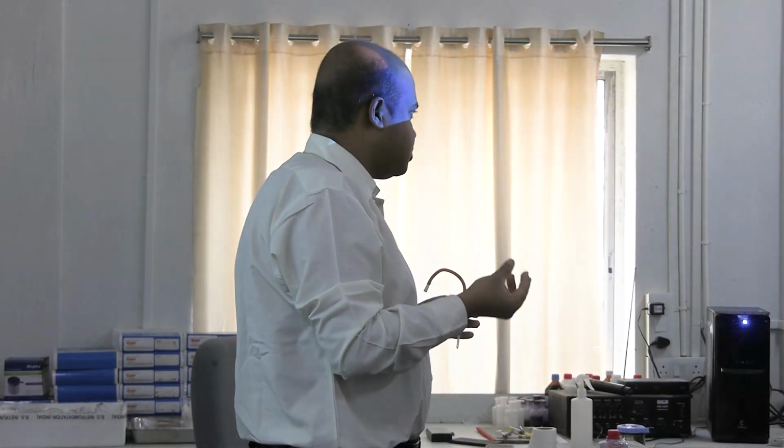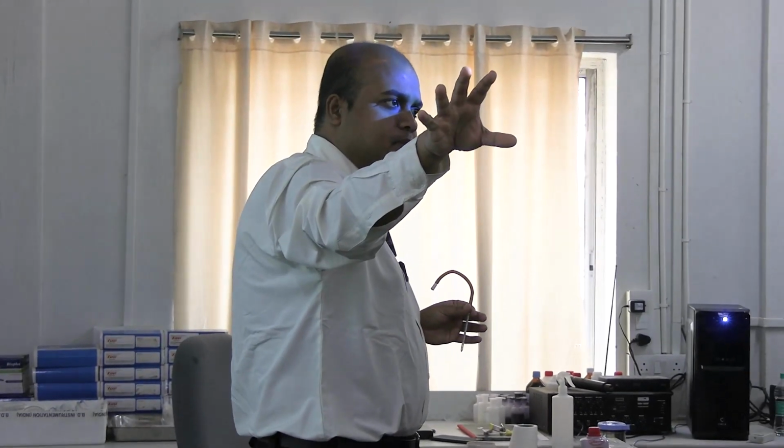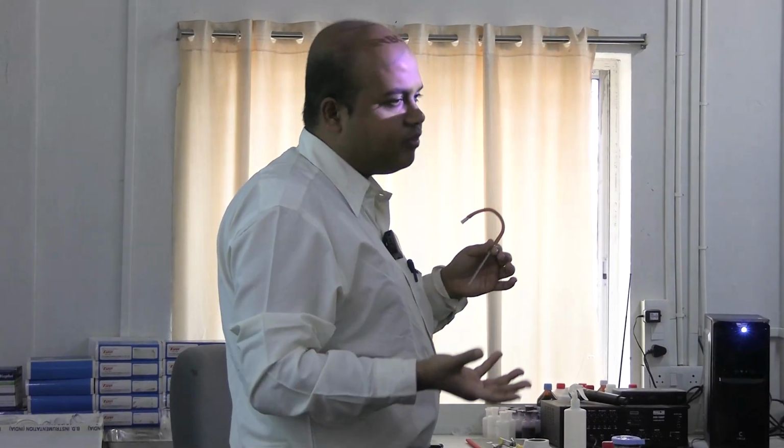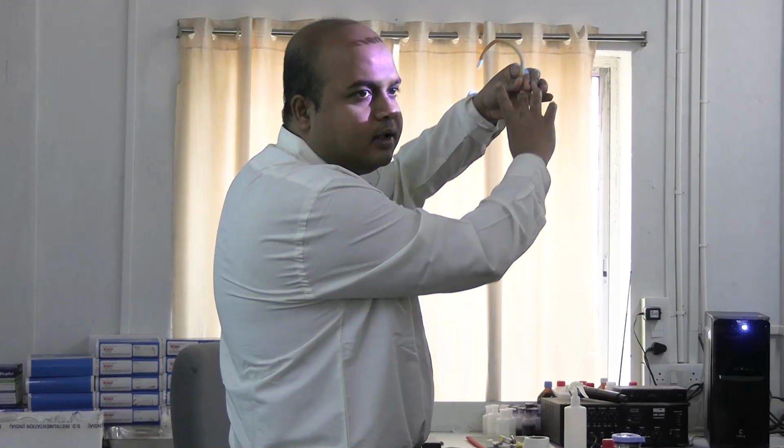So 11 minus 1 is the total solution, the diluted blood. But out of that, how much is blood? It's only 0.5 parts of volume. So 10 parts of volume of this diluted blood, but only 0.5 is actually undiluted blood. So the dilution has occurred 10 by 0.5 times. If by mistake or even intentionally we take blood up to 1, then blood will be diluted only 10 times. Now with lesser dilution, mathematically results can be expressed, but it will be difficult in counting the cells. So this has been standardized.